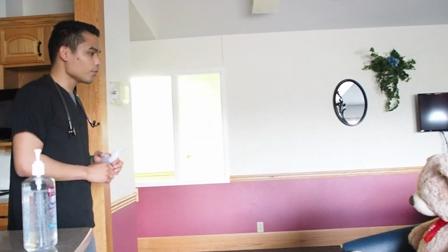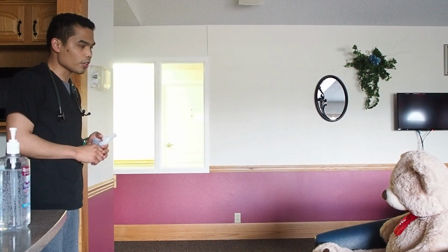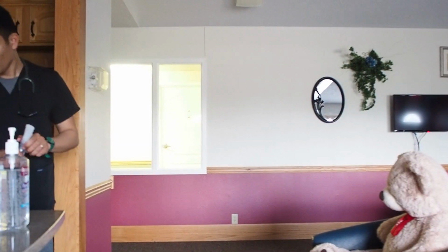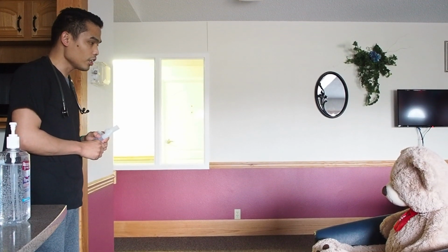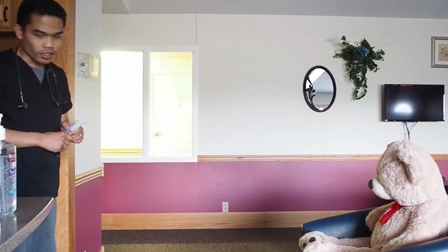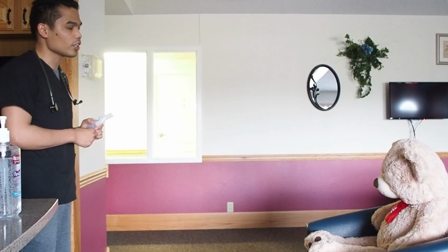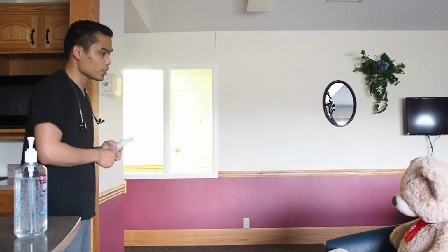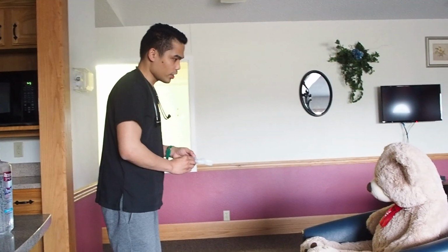So I think we're done waiting for at least a minute. The next medication that I will administer is through an inhaler, which is a dry powder inhaler. The medication that I will give is formoterol, and its name is Brovana. The medication comes with a timing of twice a day. So this here is the dry powder inhaler.